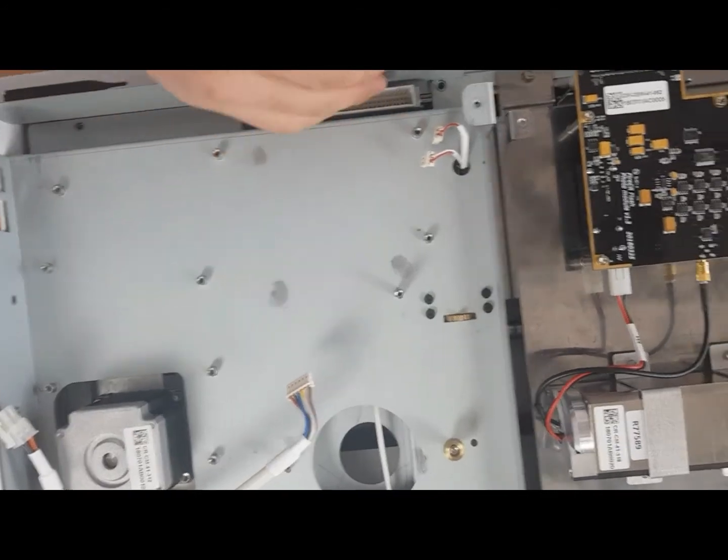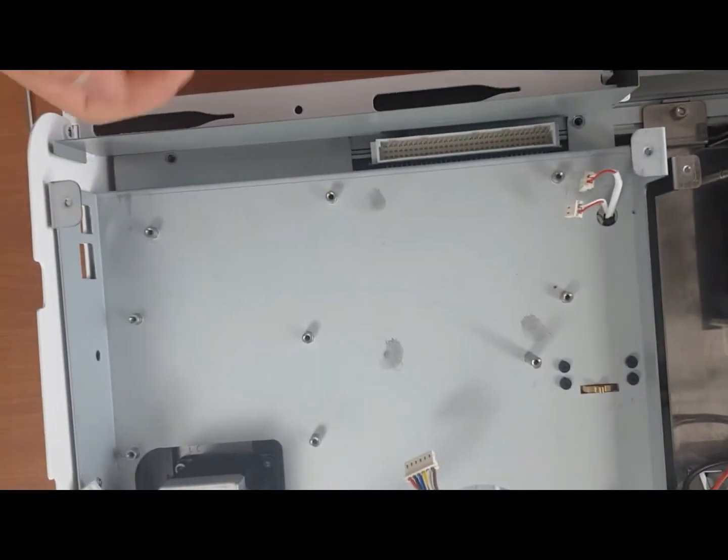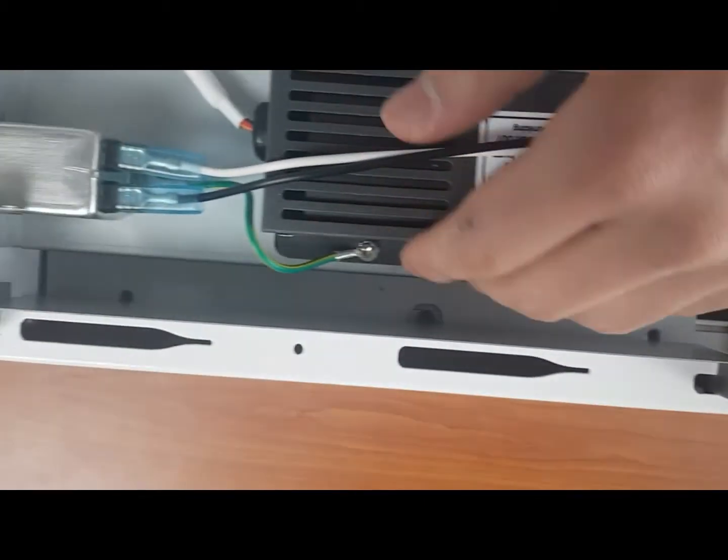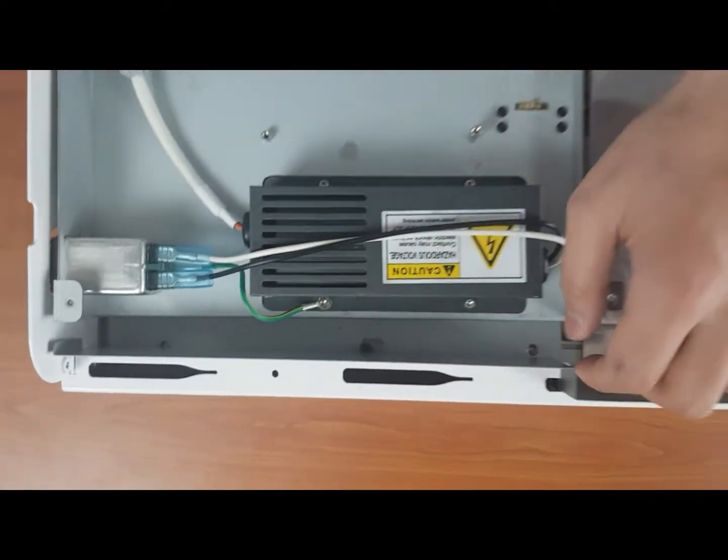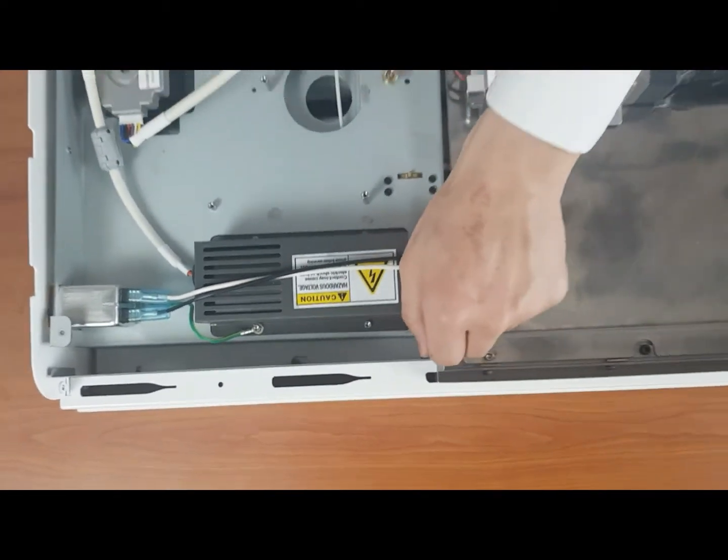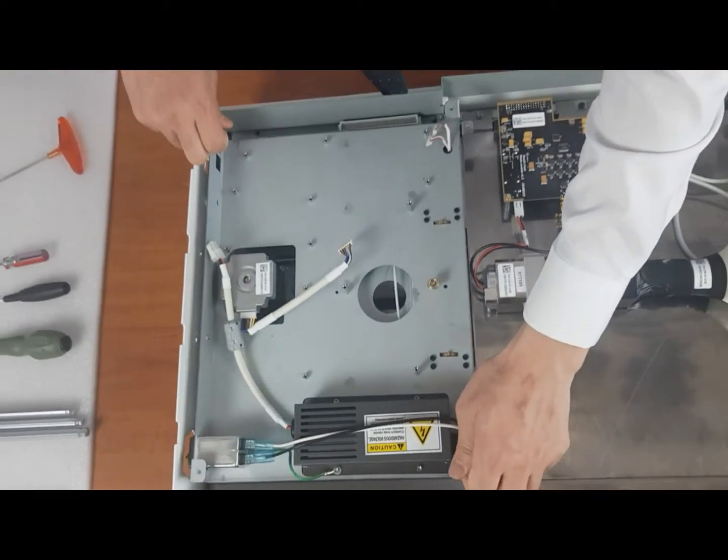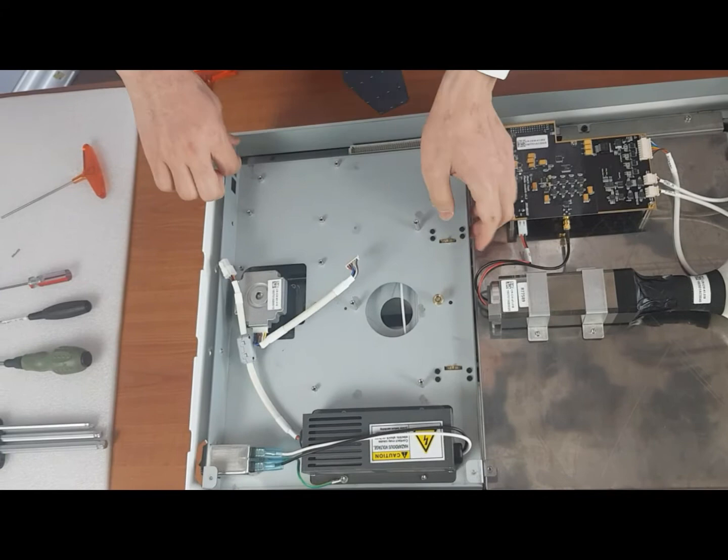Now that you've removed those four screws that I just showed you, you have to lift this part up. To do that, just carefully lift it up, but be careful of these cables here, two cables.